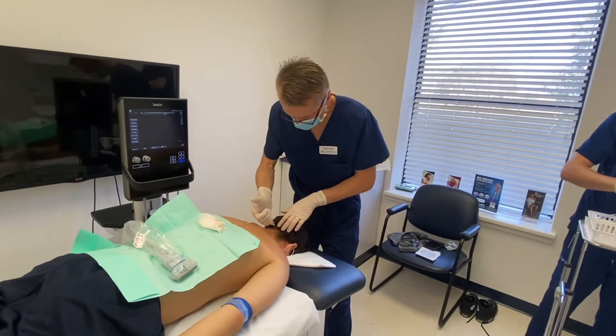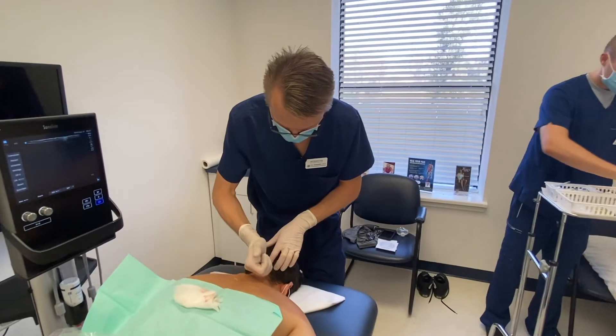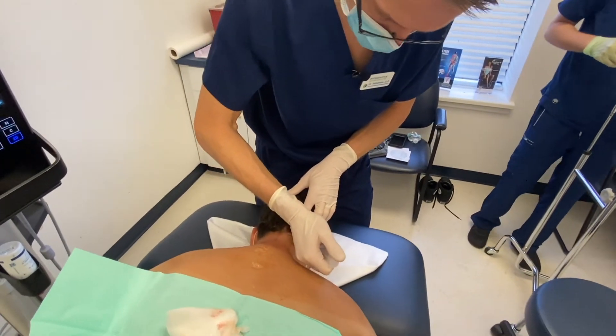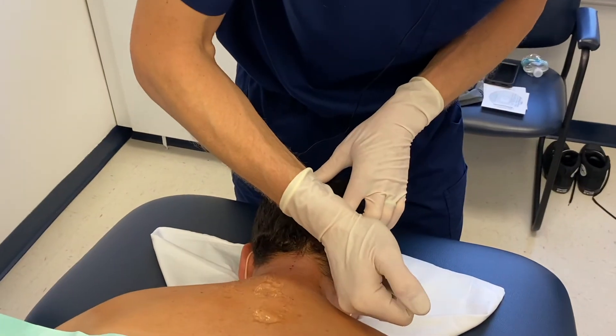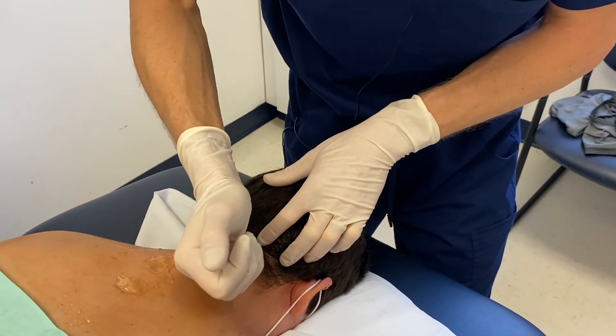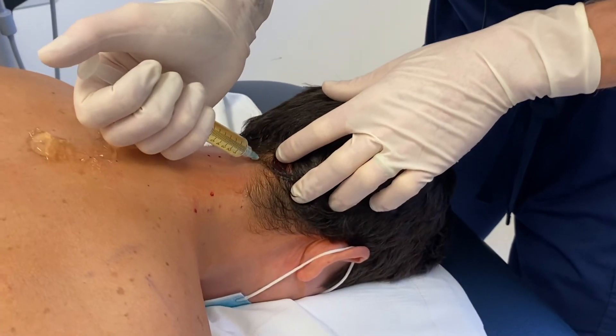The next thing we're going to inject is the occipital ridge — that's where all the occipital muscles attach. Very often, people that have instability and irritability in this area can get what is called an occipital headache. Unfortunately, this patient has one of those headaches, and we're going to stabilize that area to try to prevent those headaches from recurring.